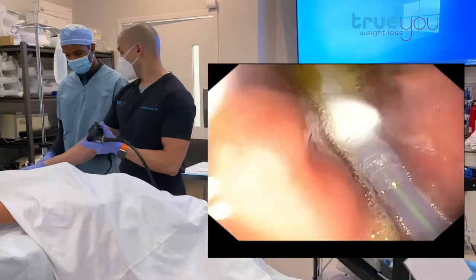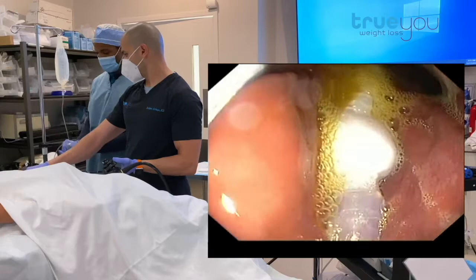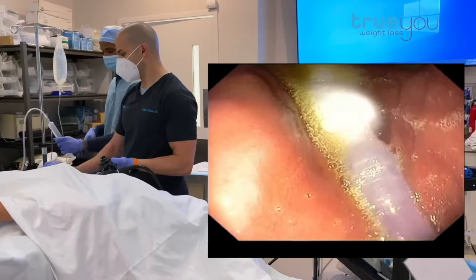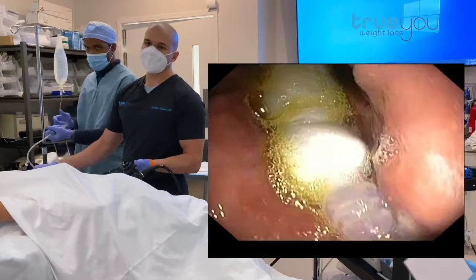Victor is going to remove the central wire so we can then connect a syringe and fill it. Our syringe is connected to a bag of fluid — just sterile saline. We like to preload the first syringe so we're ready to just push it right in. We're going to fill this 50cc's at a time. The ultimate size will depend a little bit on her stomach, but generally around 500 to 600cc's.